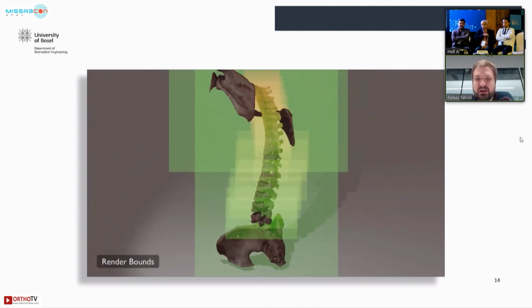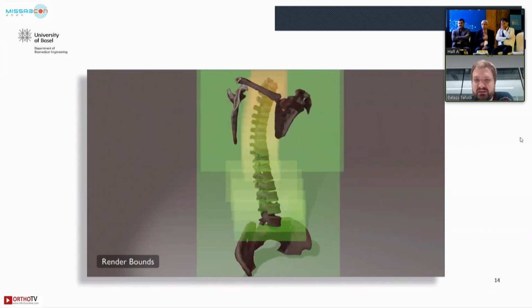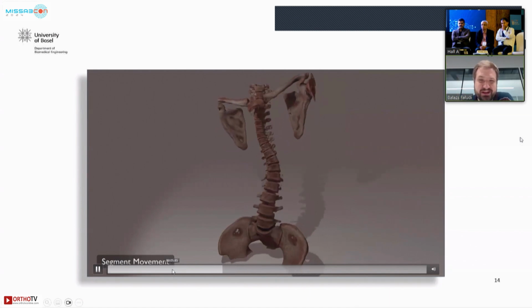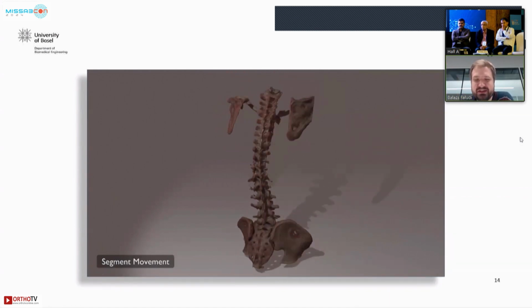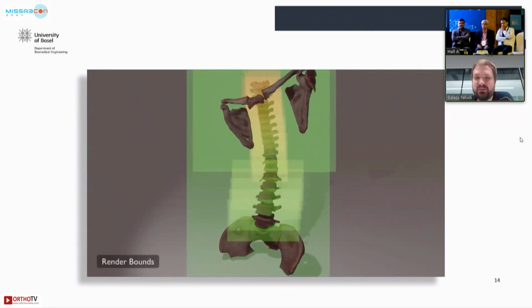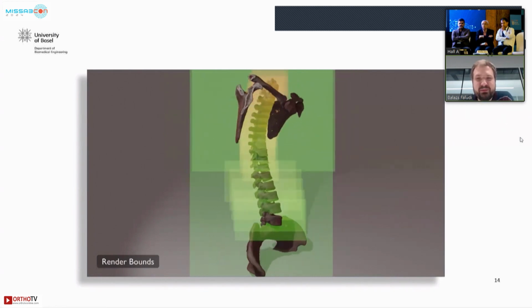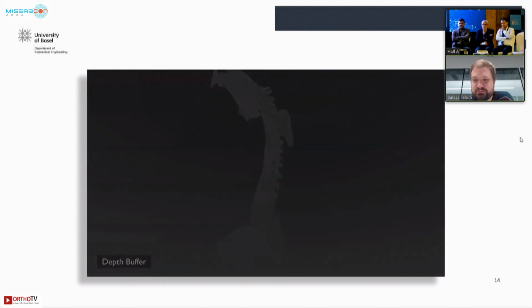But as you can see here, we can take a scoliosis data set, separate the individual vertebrae, and then move them. So this is not supposed to be a biomechanically accurate simulation. It's just demonstrating the possibility to take apart the scan and then, let's say, rearrange the bone fragments of a fracture or the vertebra, as you can see in this case.